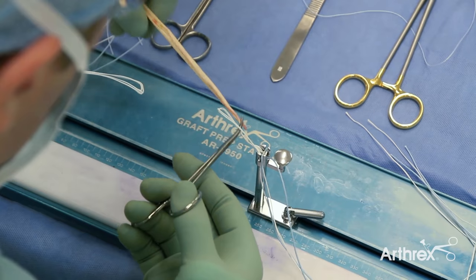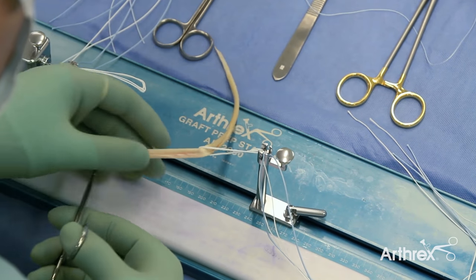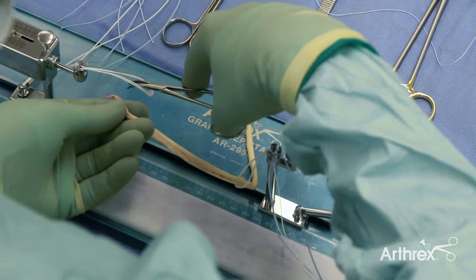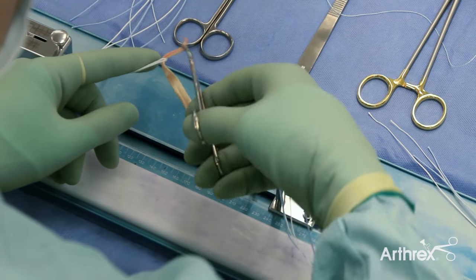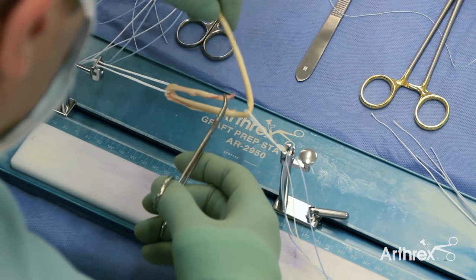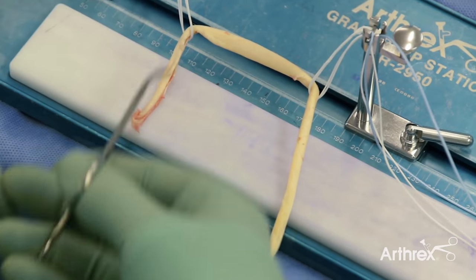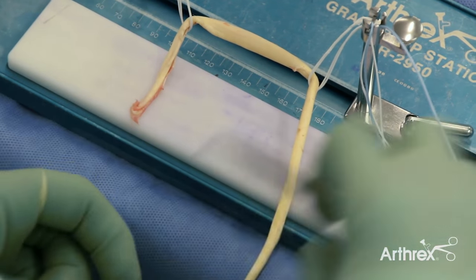First we take a small haemostat and bring the end of the semitendinosus graft through the first ACL tightrope and then through the second. This creates a short length and a long length.